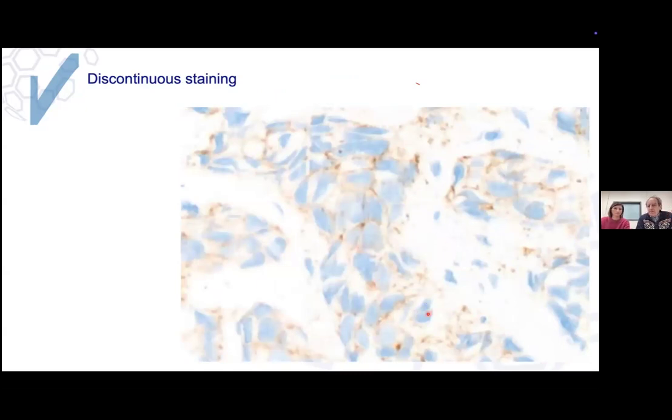Sometimes there are pictures like these. Be cautious with this kind of specimen, where you can see the nucleus like this, where you can tell there has been some poor preanalytics or some issues with preanalytics. Be cautious with these cases, even if this is a 1+ staining, and I do agree. On this kind of case, I would be tempted to say, okay, I'm telling it's a 1+, let's reflex it, because I do not think it's very good pre-analytics here, and we might be surprised.